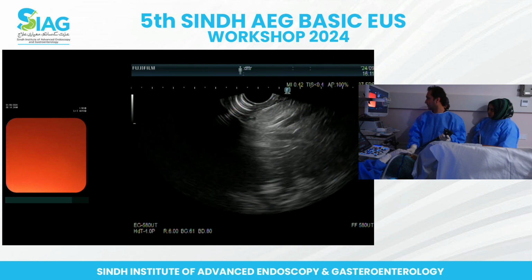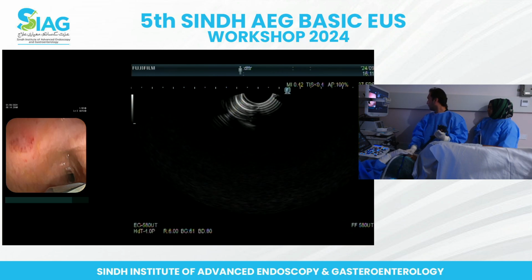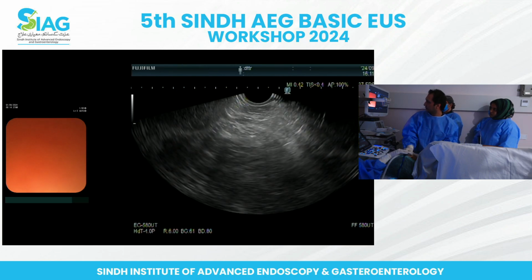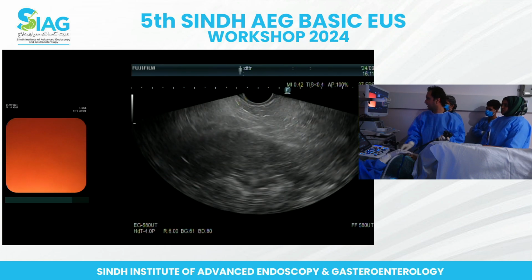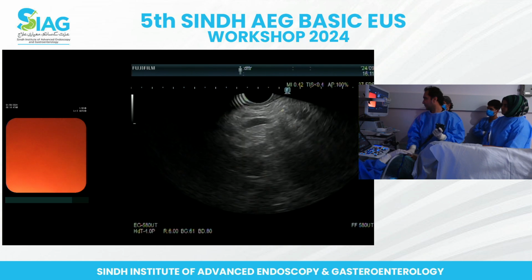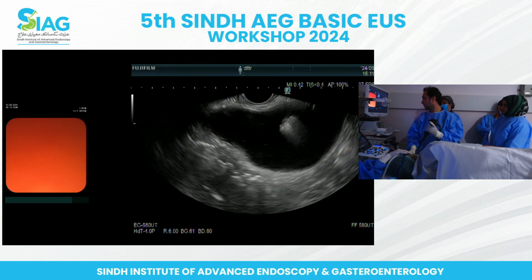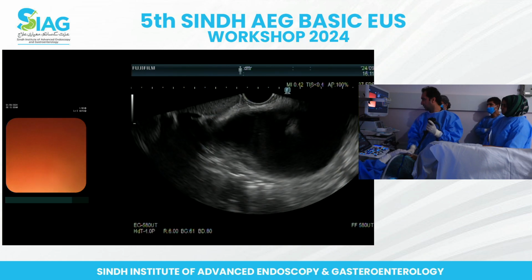So we're in the stomach. We are. That's the kidney. There you are. You're getting some of the renal vessels you just saw. Yes, very nice. That's your gallbladder coming. So you probably are too much onto the anti-clockwise. So start going to the clockwise now.